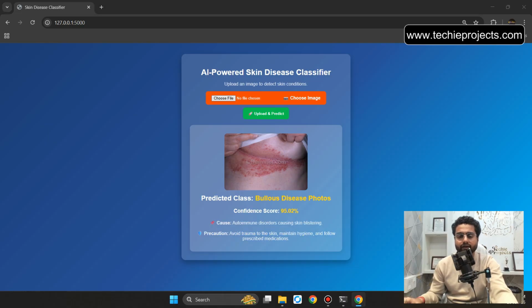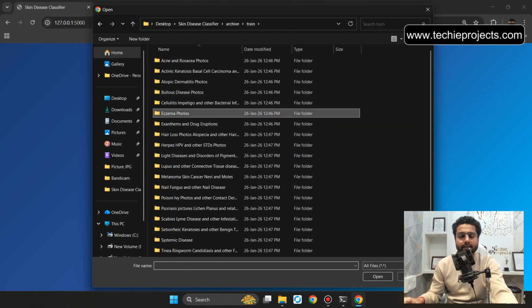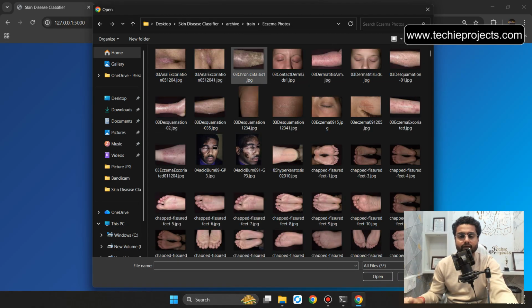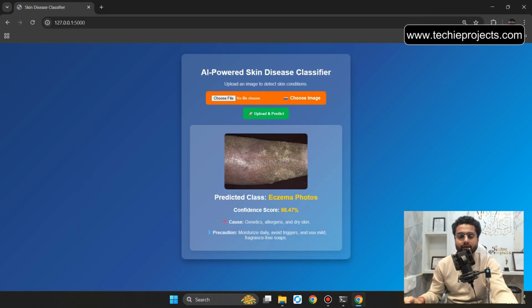So let's choose any other file. Let's select from any other folder. Select from eczema photos. Let's select this image and then click on upload and predict. Now it will predict the class eczema photos and confidence score 98.47%. The cause: genetics, allergens, and dry skin. Precaution: moisturize daily, avoid triggers, and use mild fragrance-free soaps.